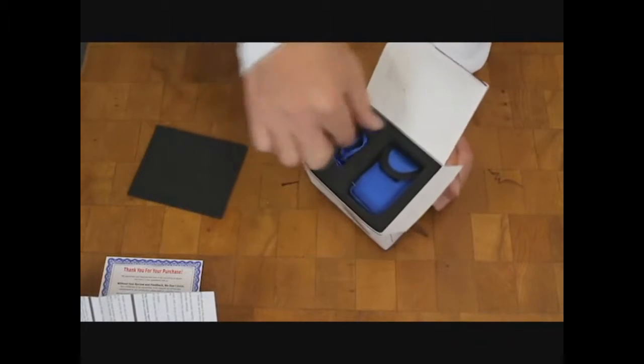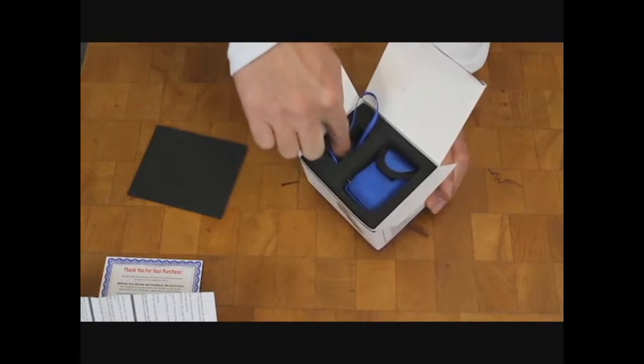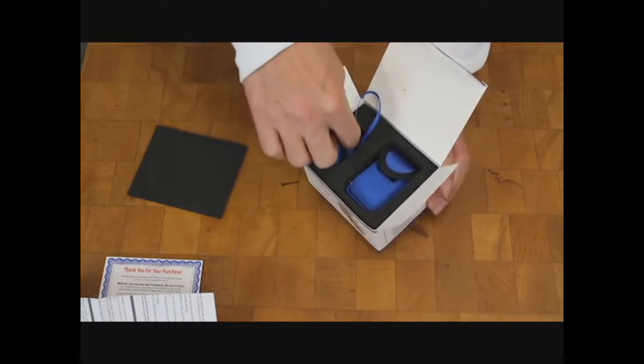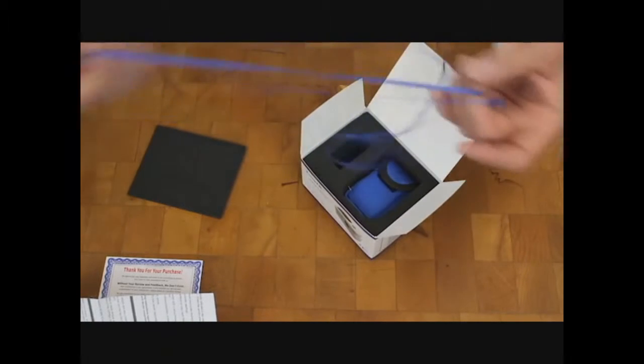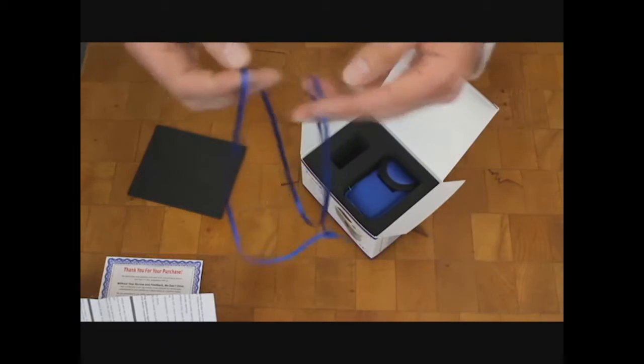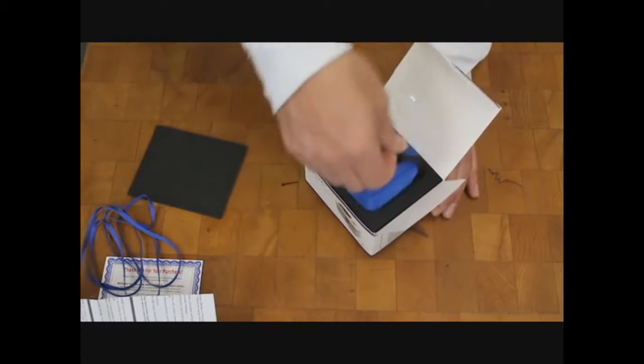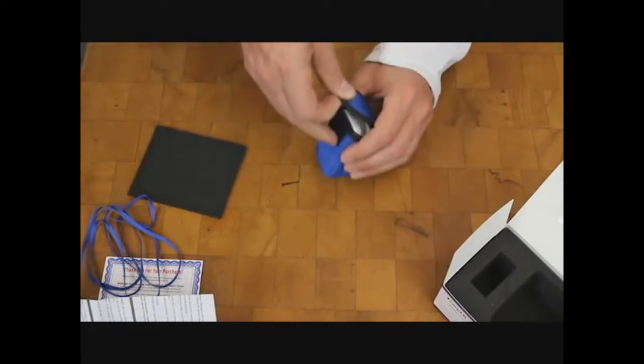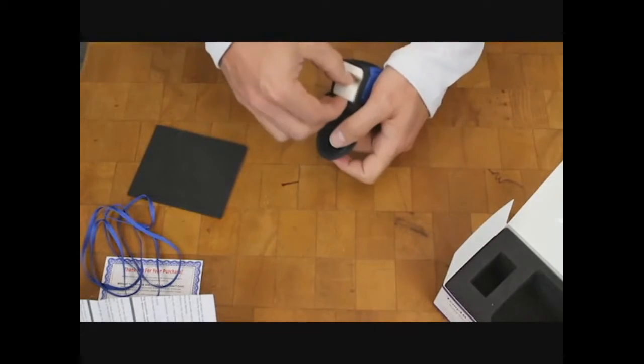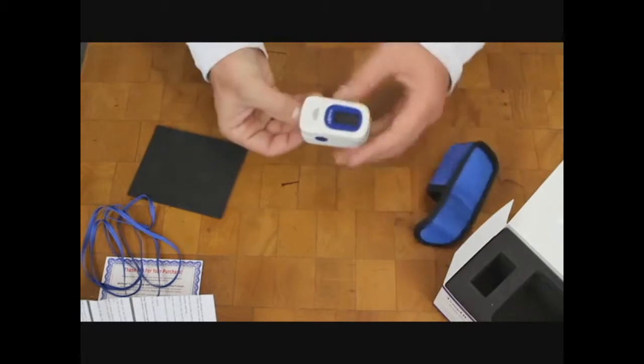This is how it comes. There are two AAA batteries in here; it comes with the batteries. I've already installed them and been playing with it. This is the lanyard that it comes with so you can put it around your neck or whatever you want. It comes in this really cool little case just like that.